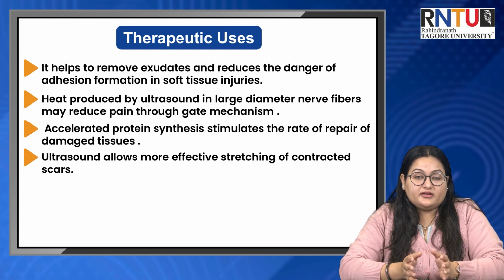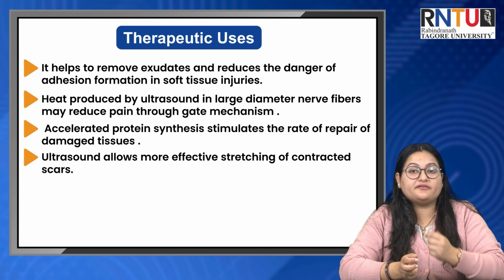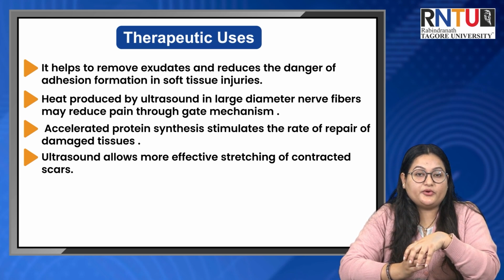Here in conclusion, ultrasound therapy stands as a valuable asset in physiotherapy. Summarize the key takeaways and its significance in promoting healing.